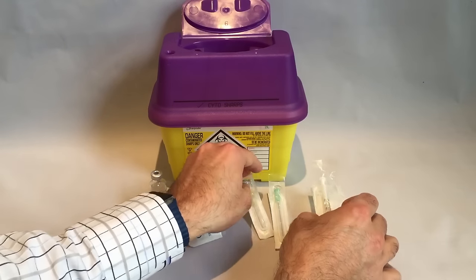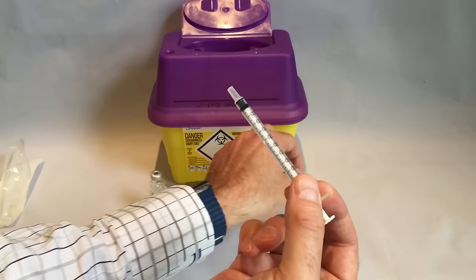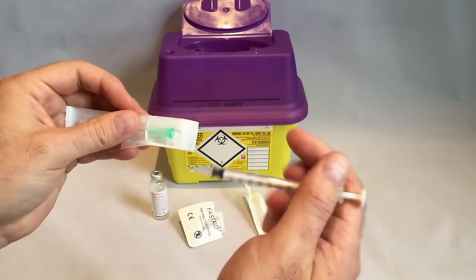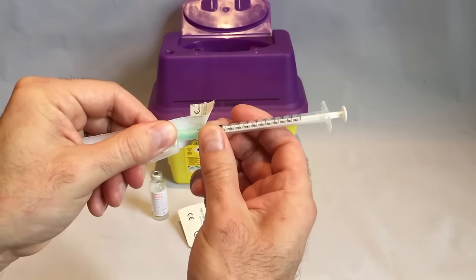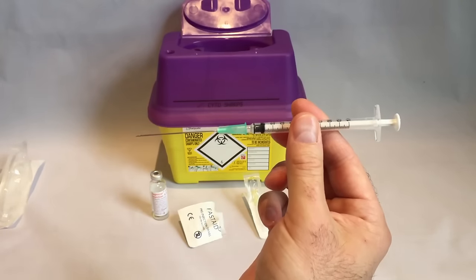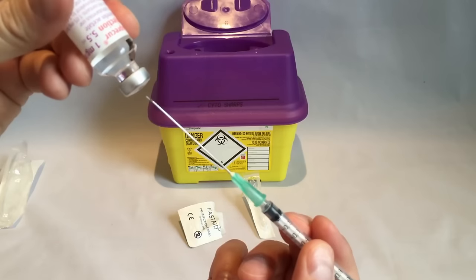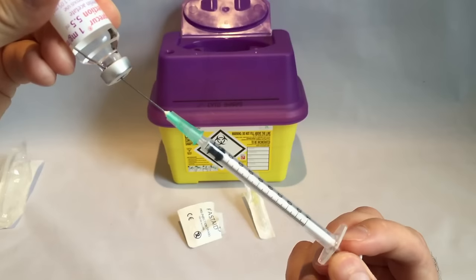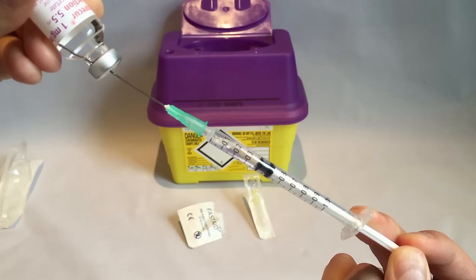We are going to be using the larger green needle first to draw up the medication. Take the syringe out of its packaging and gently push it into the opening of the green needle. You may want to rotate it a little to make sure it is firmly fixed into position. Remove the needle cover carefully — this can sometimes be a little difficult so gently wiggle it back and forth, making sure it doesn't spring out and injure you. Take the medication bottle and hold it upside down at a slight angle. Insert the needle carefully through the grey self-sealing opening. Make sure the tip of the needle is in the liquid and pull back on the plunger, drawing the liquid up into the syringe.